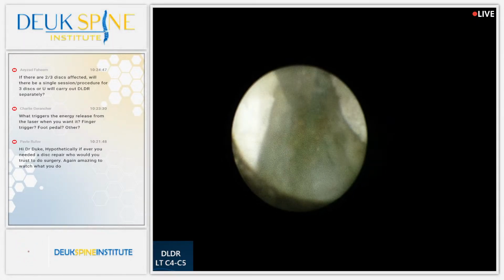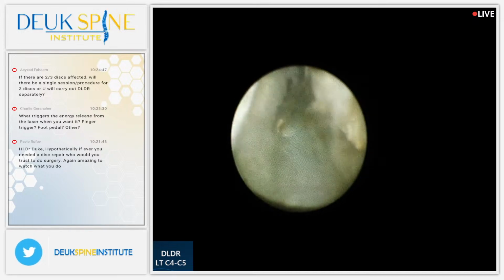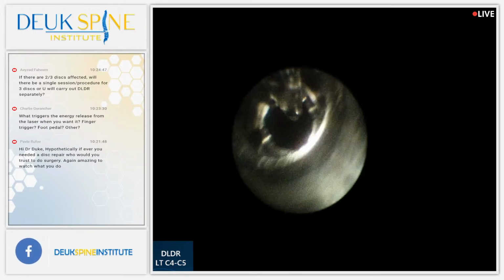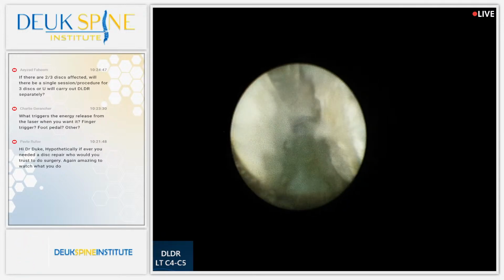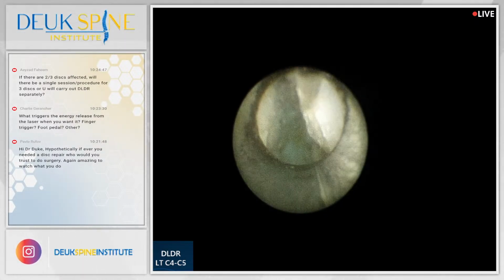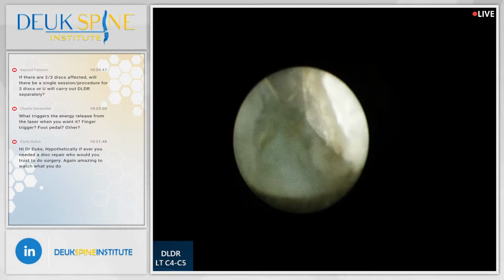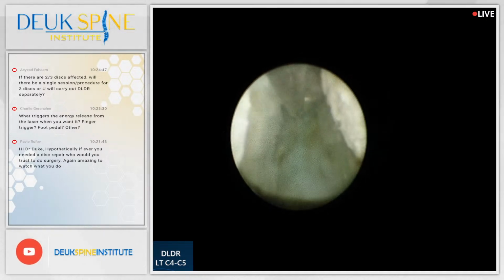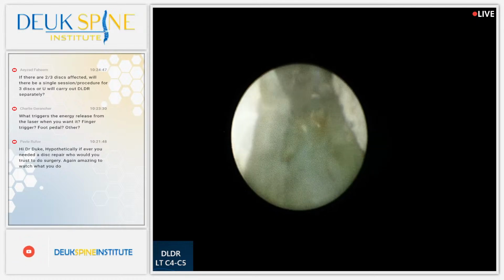Yes, you are. All right, any more questions? We're just about done. Again, oh, beautiful. Look at that piece. Look how calcified it was. Huh? That was a good piece. And Luis, are you getting some pieces together? Well, the other one I said they ready. Oh my God, Luis, how could you? I'm just kidding. Guys, we're done. This is it. I just went out the other foramen. Look at that. Amazing. This is truly incredible, huh? Oh yeah, she's going to do so good.